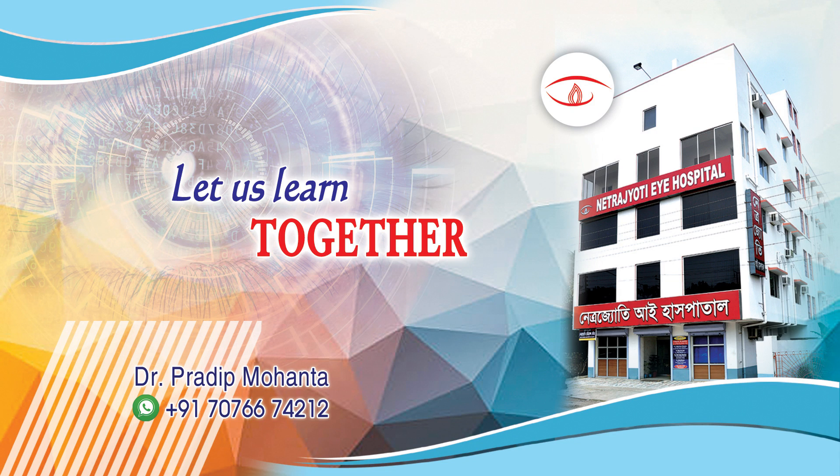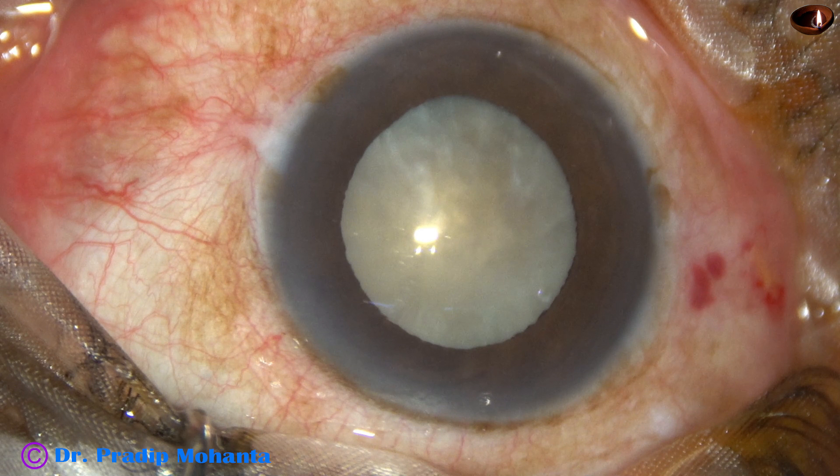Friends, welcome to my workplace at Ranaghat, West Bengal, India. This is a mature senile cataract. Let us observe management of this case.